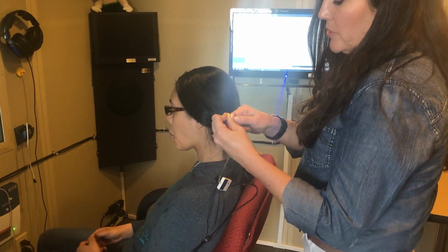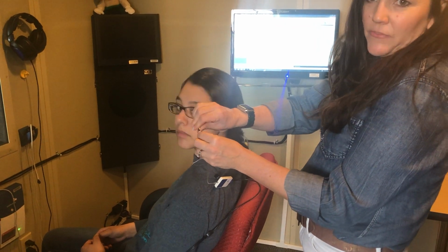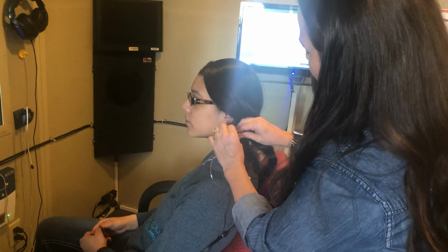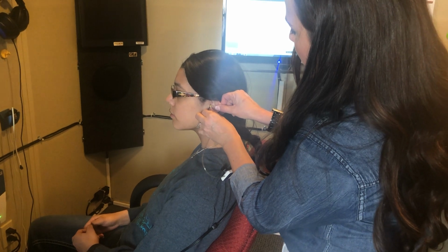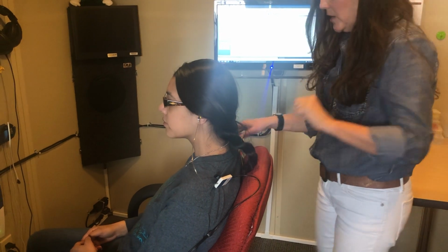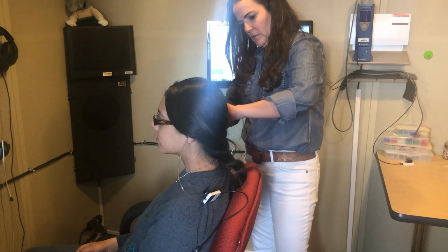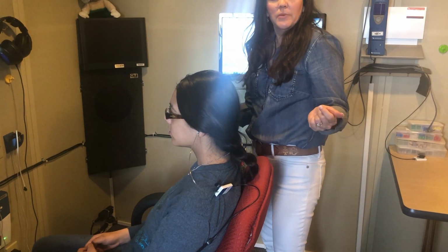When you place the insert earphones, you're going to roll them up, kind of like if you've ever done earplugs. Roll them up, pull so they're really small, pull up and back, straighten that canal, and place it in the ear until pretty much none of that yellow is hanging out. Then give it just a second while it expands. Do the same thing on the other side. And then she's ready to begin.